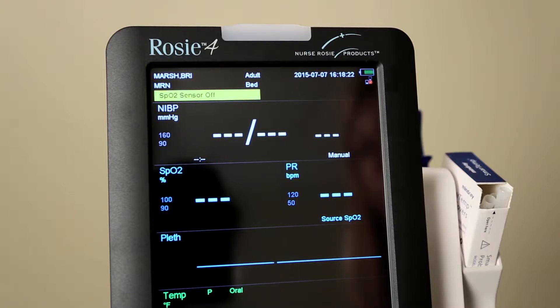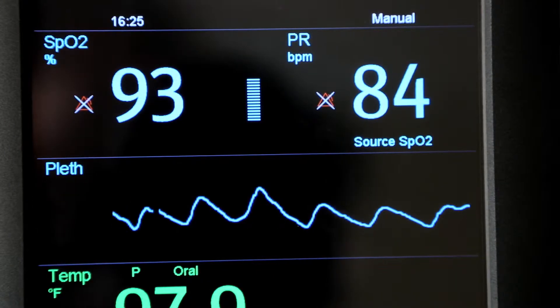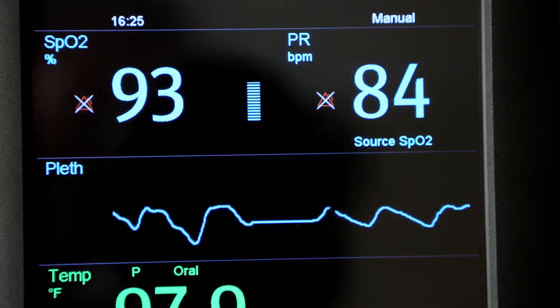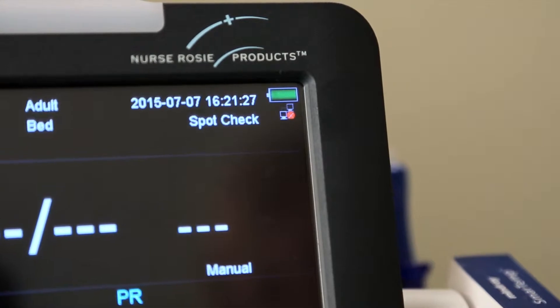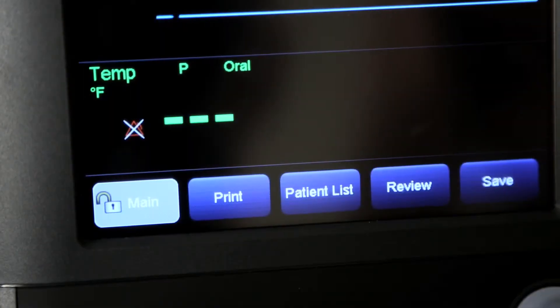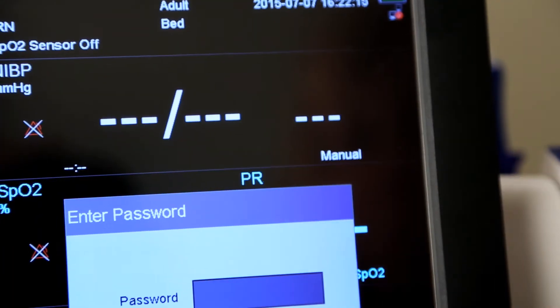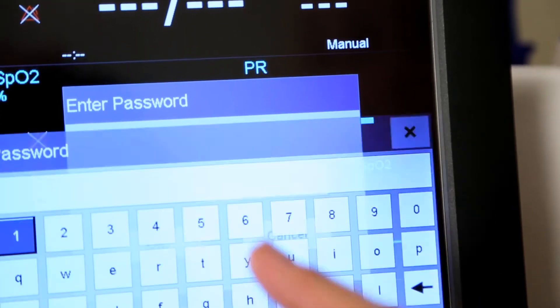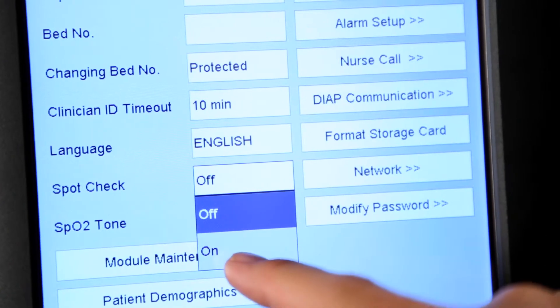Rosie 4 will automatically enter monitor mode after power on. Monitor mode is a common mode for monitoring patient vital signs. The spot check mode is intended for on-spot measurement in a short time period. When spot check mode is on, it displays in the network and USB connection area at the top of the screen. To change to spot check, select Main, Maintenance, User Settings, enter the required password — user settings 888-888 — then select On for spot check.